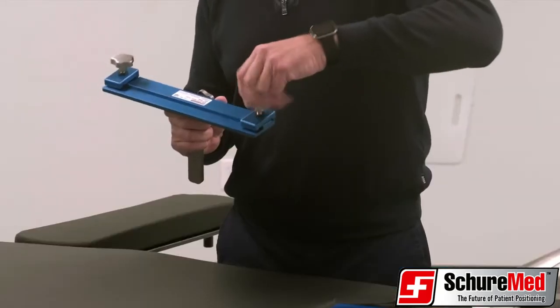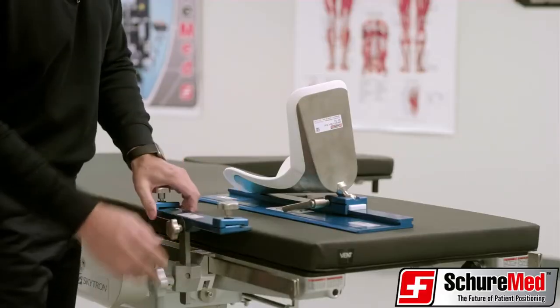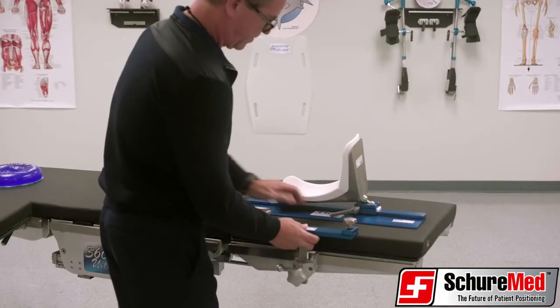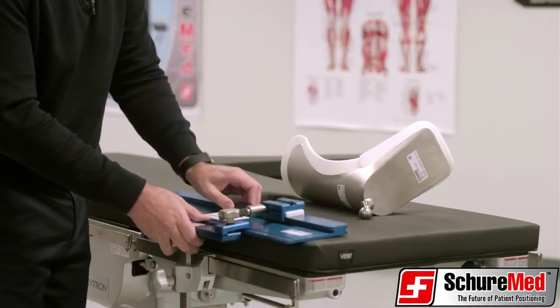Slide the stainless steel mounting bar into the camlock clamp and secure at the appropriate height with the star knob. Ensure that the TKR base plate is flush with the cross-support bar prior to tightening the knob.